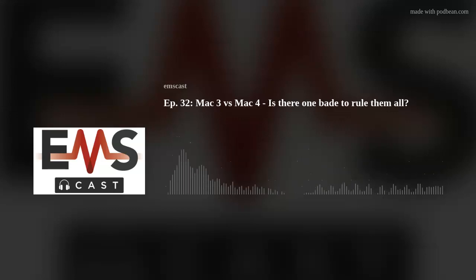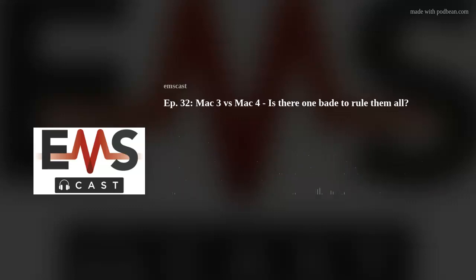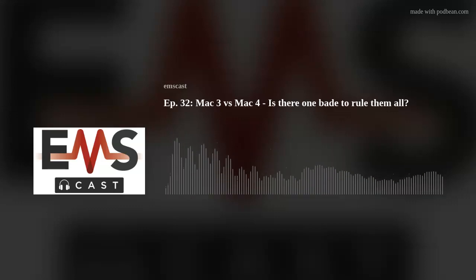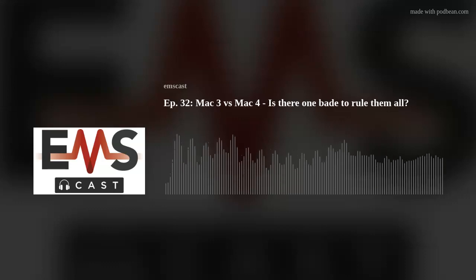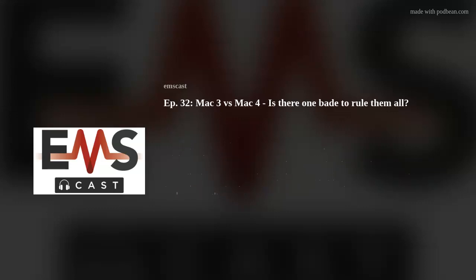And the background was essentially what we just talked about. Like there's a lot of dogma about why you should always use a Mac 4, and then there was a lot of good hypothesis about why you should always use a Mac 3. And I think that they attempted to be the first true study to answer this. There's 2 previous studies where they did this with a mannequin and then in 30 patients with no teeth. And both of those showed preference for the Mac 3, but this was the first one where they were doing this in a more organized approach on real people.